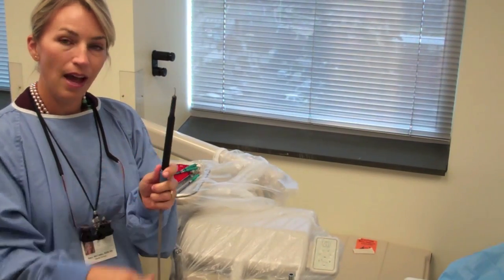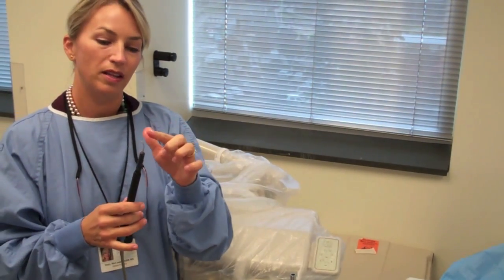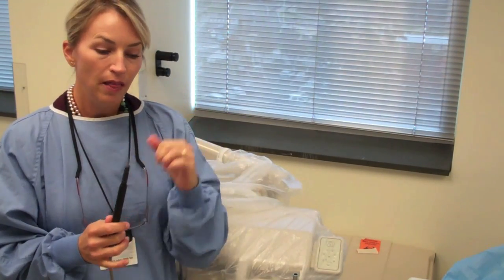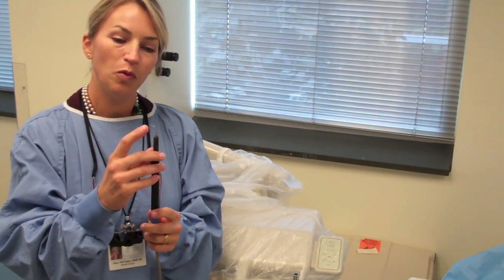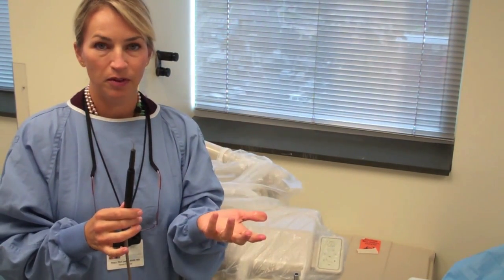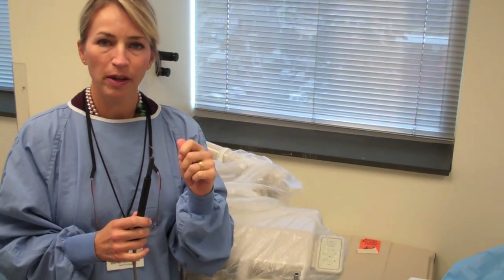Understanding which insert you need to select for the type of patient that you have is definitely key and very important. The other thing to think about is that most ultrasonic insert manufacturers have little wear indicator cards. These are critical. If your assistant does the ordering, don't have your assistant throw that card away. It's going to help you understand how much of the ultrasonic insert is worn. An ultrasonic insert becomes less effective as the tip wears back. So for maximum effectiveness, so that we don't burnish calculus and have better clinical outcomes, you're going to want to go back and reference that card so that you can make sure you're using effective tips.